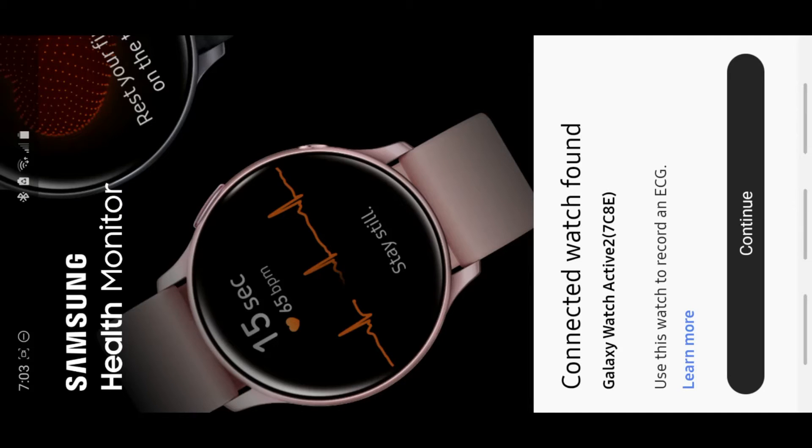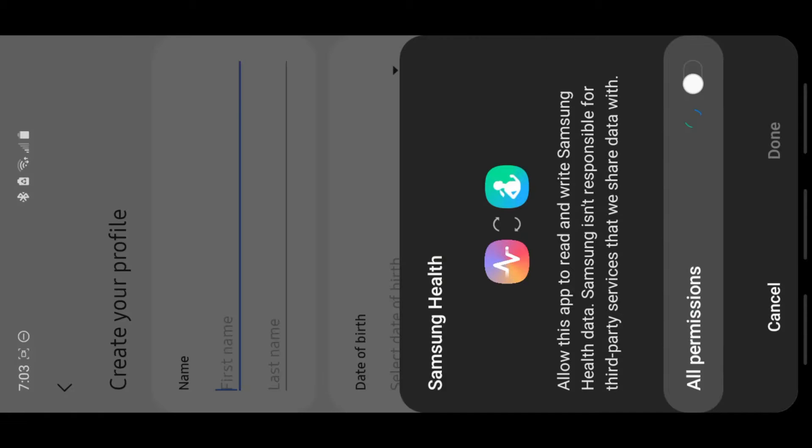Once you open the Samsung Health Monitor app, click Continue. Allow permissions. Fill in your date of birth, your name, and your gender. You must be 22 to use this app, but I'm not 22, so I'm just going to put a different year for my birthday.